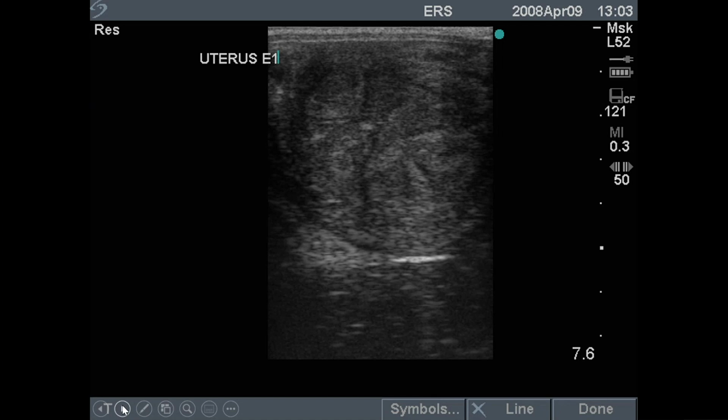Our system is, we used a numbering system, so 0, 1. And this is what we would call endometrial score 1, E1. Now, you might call it something else. It does not matter because it's a relative diagnosis. So whether you call it a 1 or call it a 2, it doesn't matter, as long as it's relative to you. You're looking for the increase and decrease.